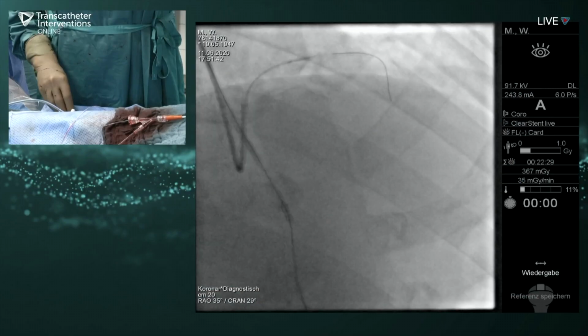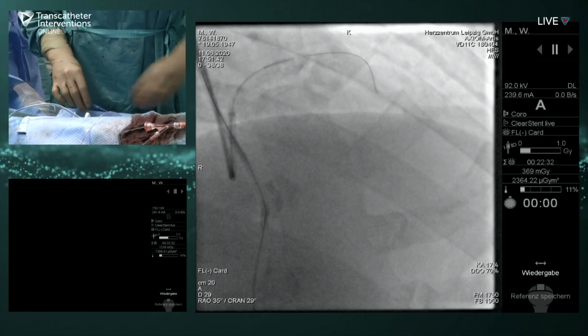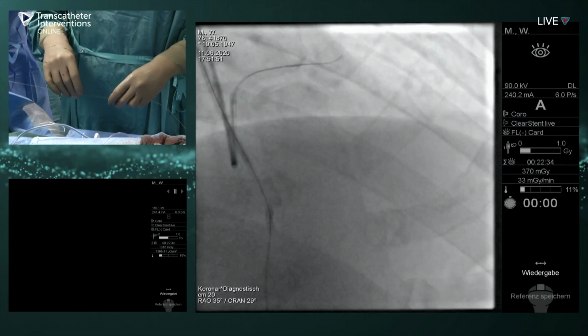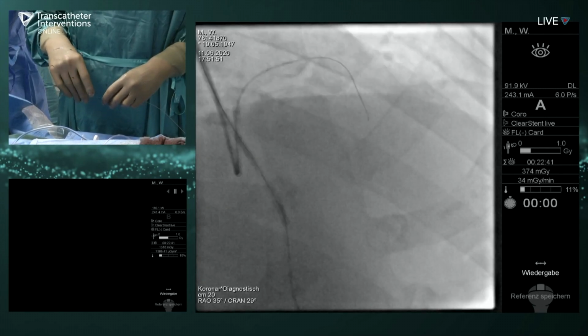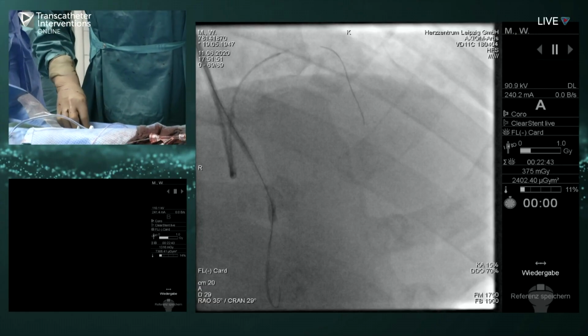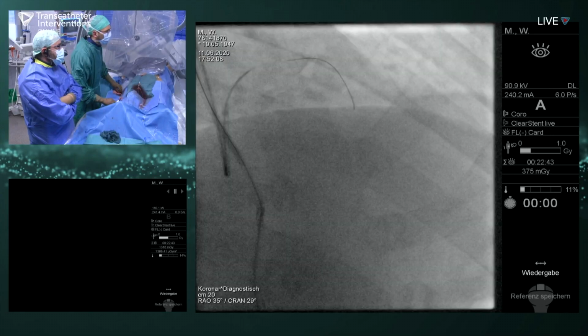So there are actually 2 septals just before and just after this old stent. And our main target would be first the second septal collateral immediately after the stent, which I think is this one. Yeah, this is this one. Yeah. So now I try to... We will probably start to struggle a bit with the 6 French, as you anticipated.